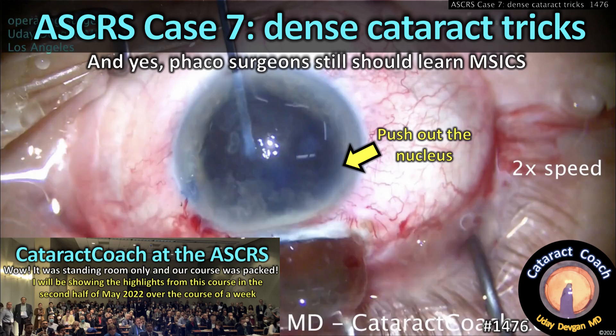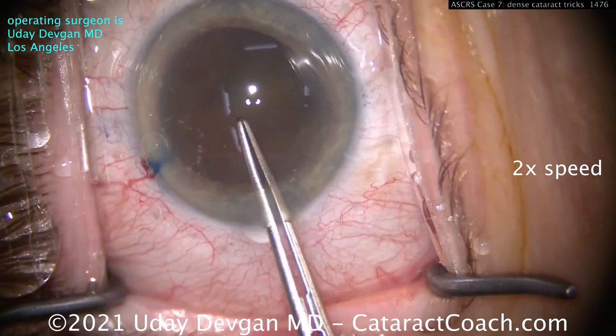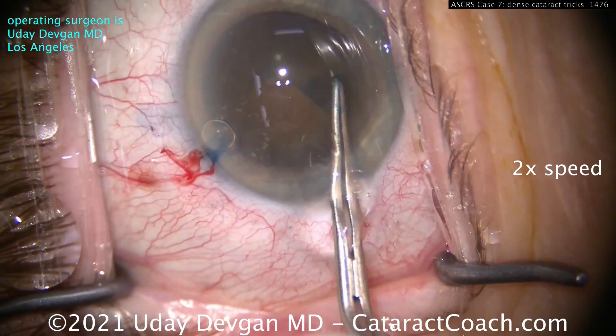CataractCoach.com, ASCRS case number 7: dense cataract tricks. And yes, you still have to learn SICS, so here's our case.